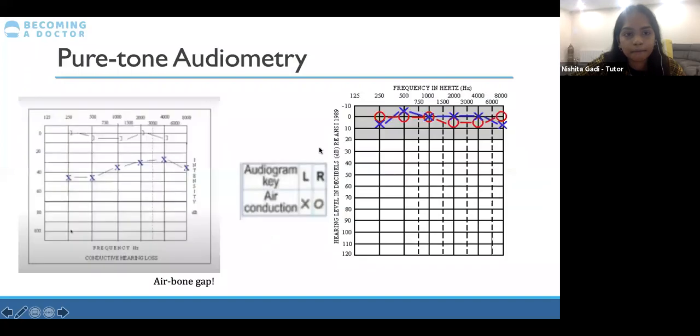So yeah. Okay, now we'll go through a bit about audiometry, so how to interpret audiograms. I do understand that this might look a bit scary, but it's honestly very, very simple to grasp. So you have the x-axis and you have the y-axis. The y-axis is the intensity of the sound. So as we said, the decibels.